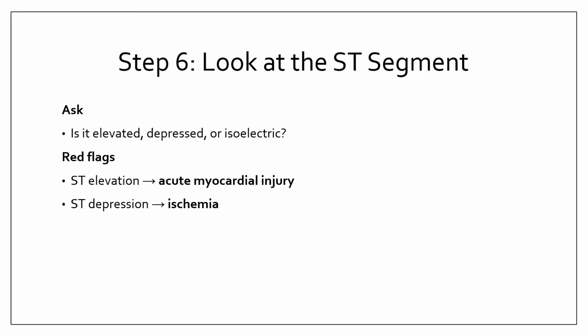it elevated or depressed? So a red flag is when we see ST elevation, which indicates acute myocardial injury. And this suggests an ongoing infarction or full thickness myocardial damage. This is a medical emergency.